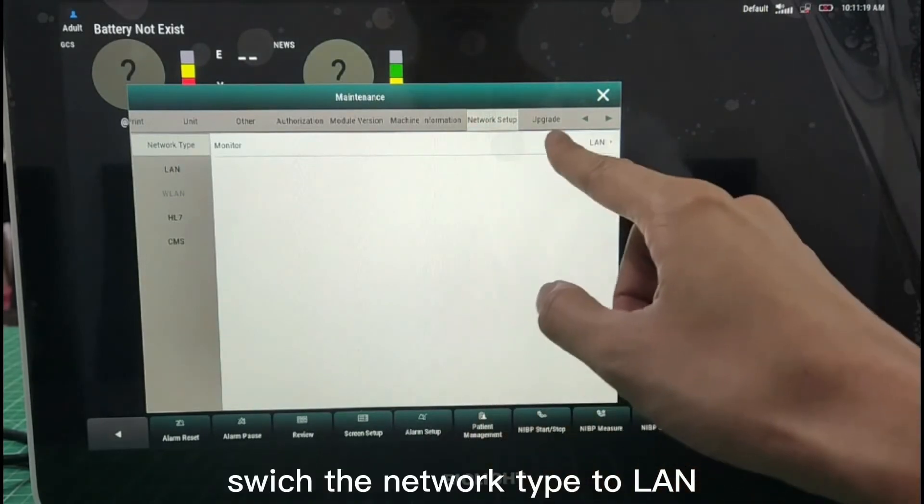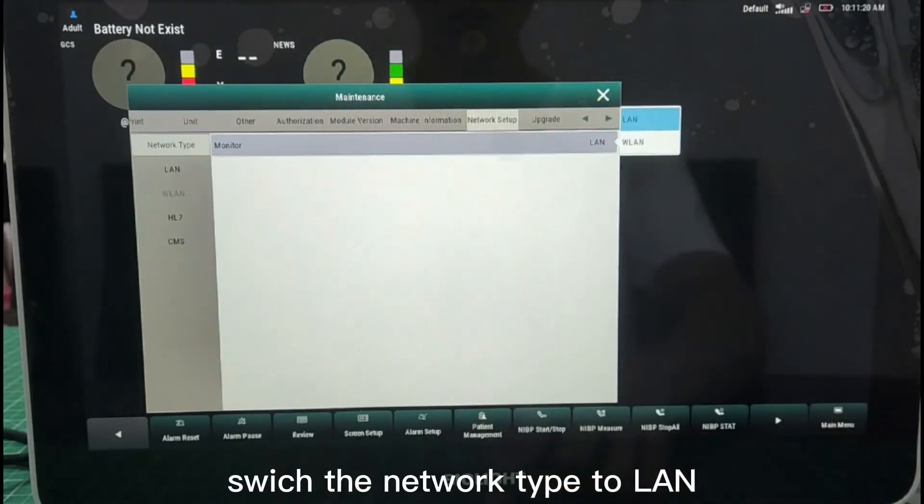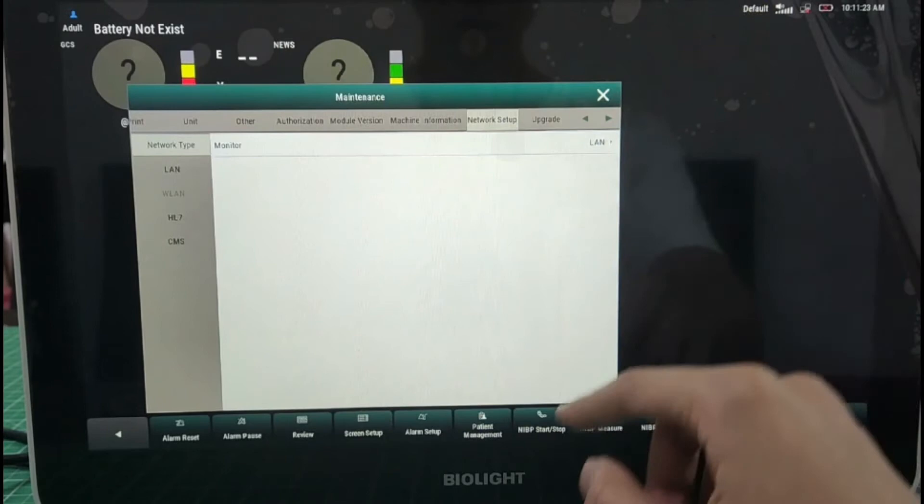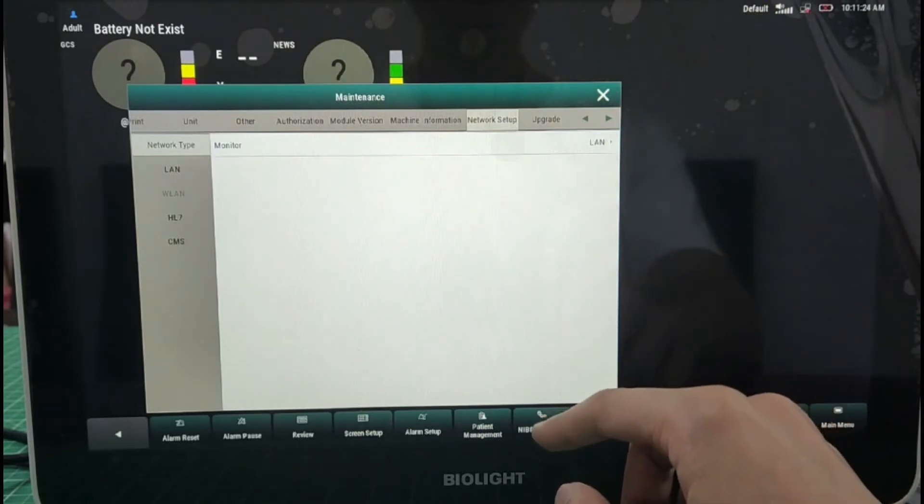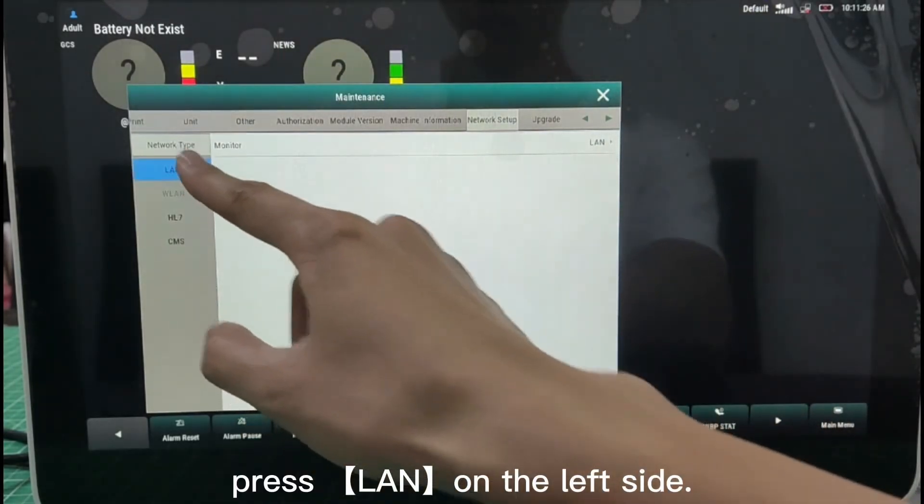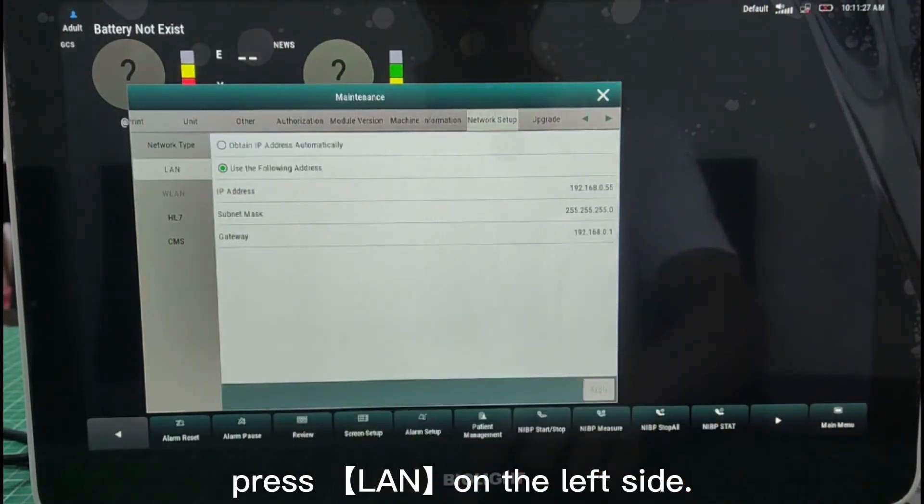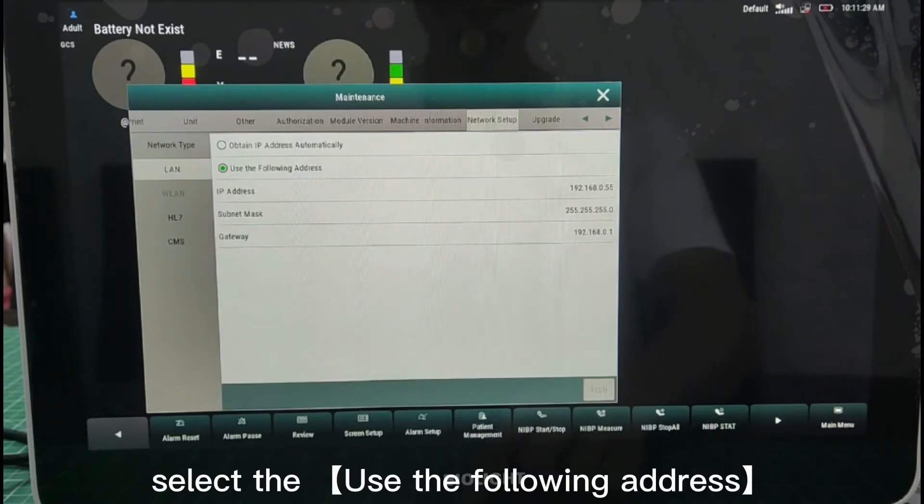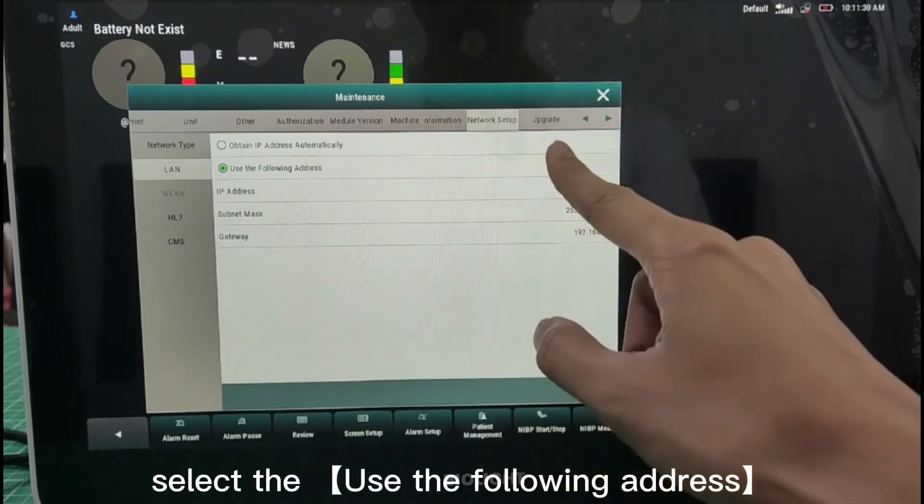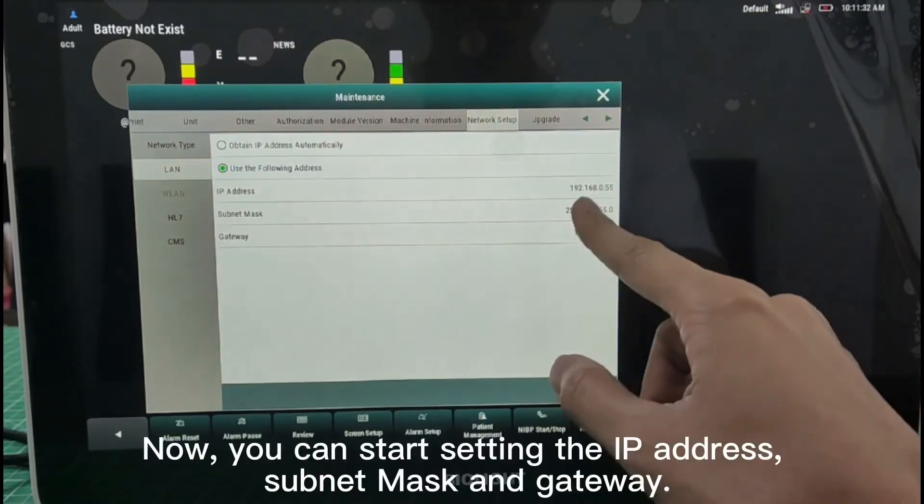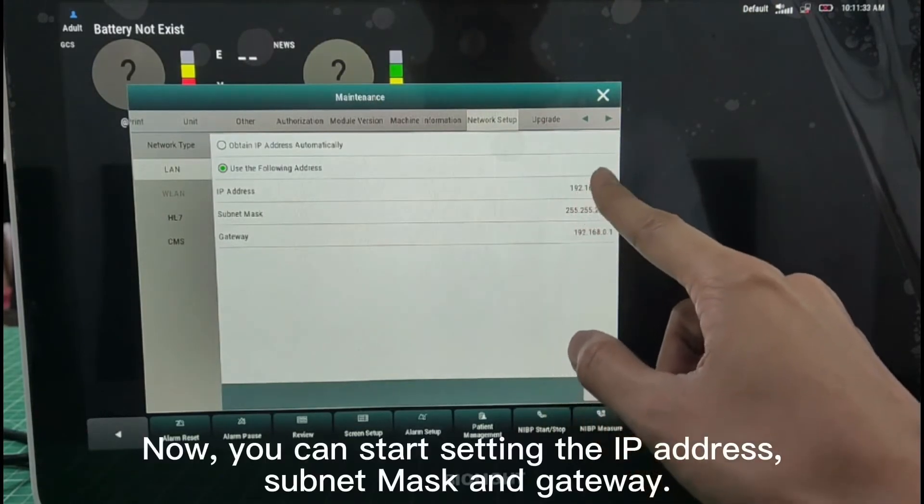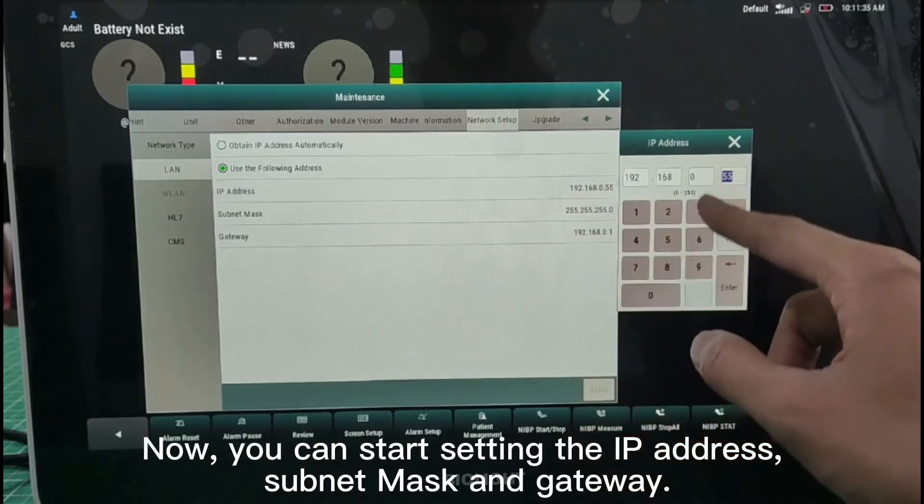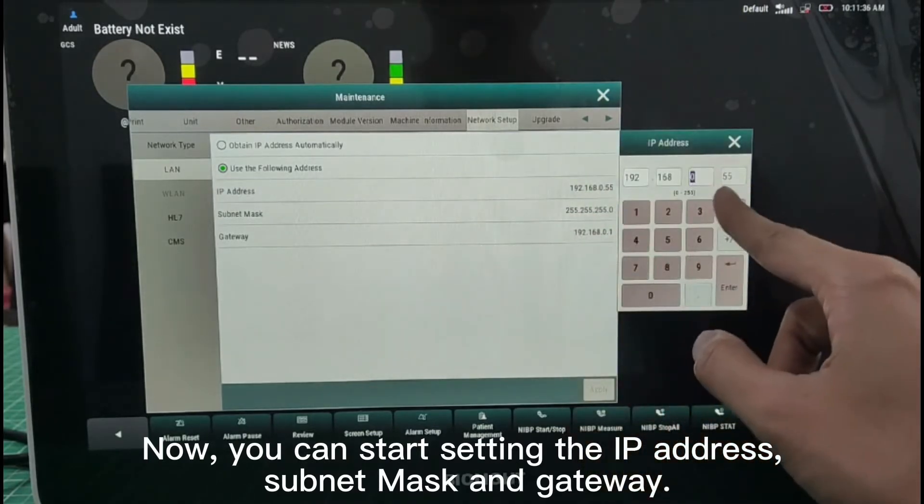Switch the network type to LAN. Press LAN on the left side. Select the Use the following address. Now you can start setting the IP address, Subnet Mask and Gateway.